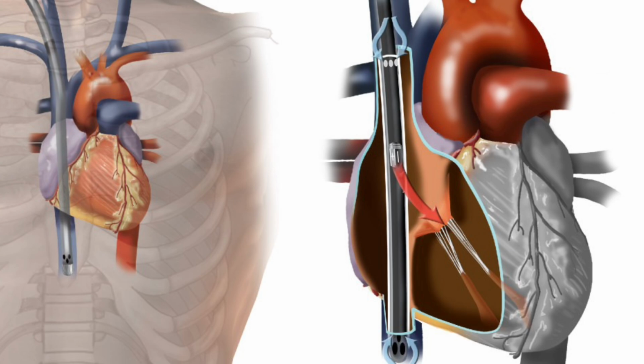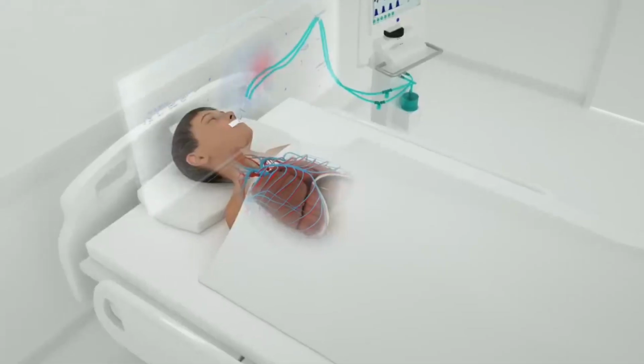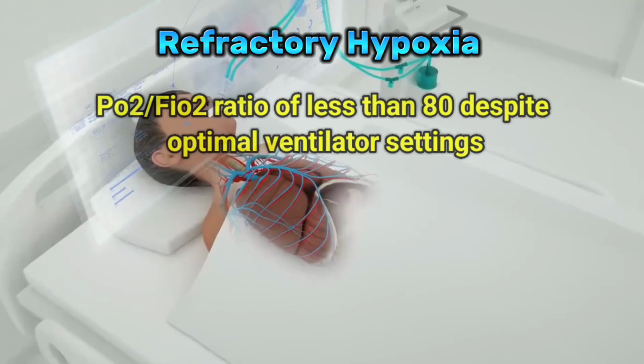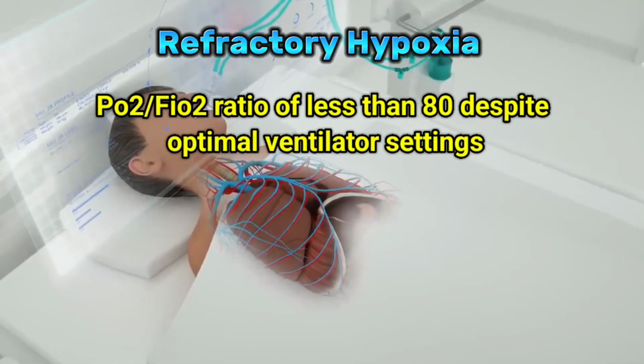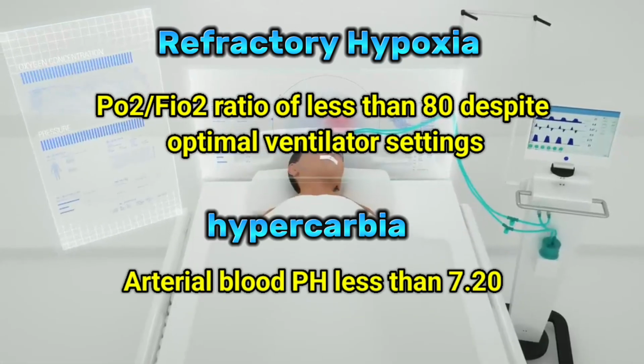So we initiate VV ECMO when conventional mechanical ventilation fails. The primary indication is refractory hypoxemia, defined as a PaO2 divided by FiO2 ratio of less than 80 despite optimal ventilator settings, or severe hypercarbia with arterial pH less than 7.20.